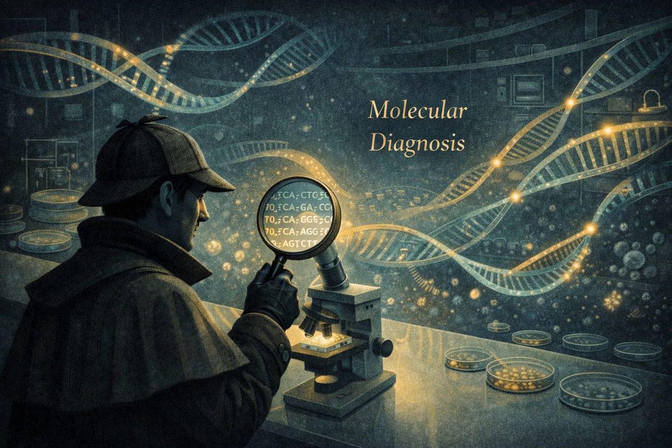It's that simple. But just sticking isn't enough, right? You need to know that it's stuck. You can't see a single DNA strand with your eyes. Correct. And that's why the probe always carries a tag. It's like a fishing hook with a little glow-in-the-dark bobber attached to it, so you can see it.